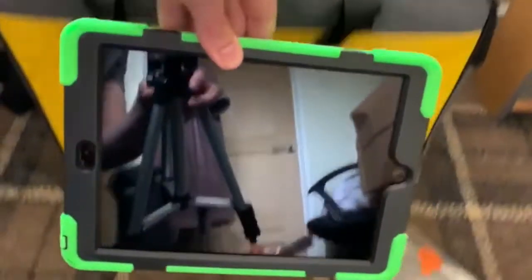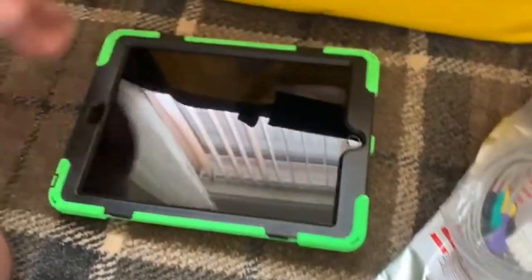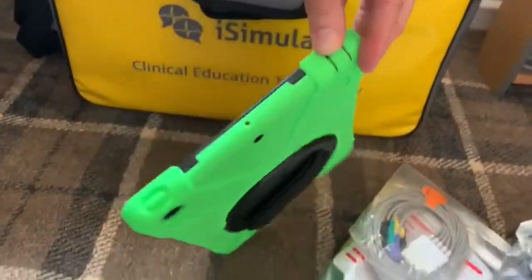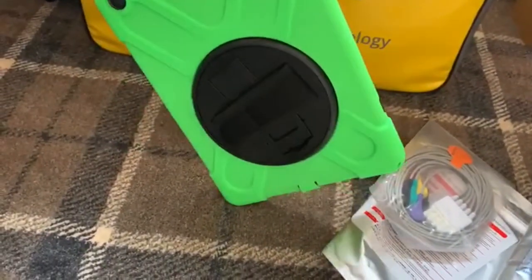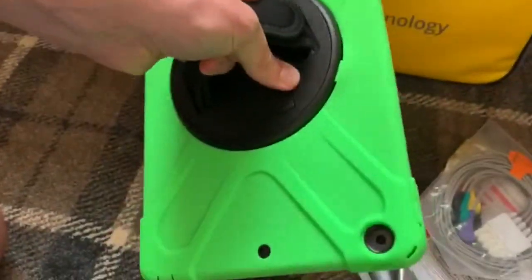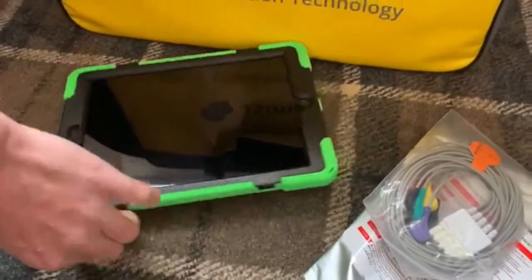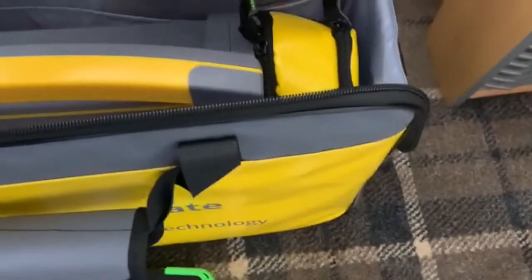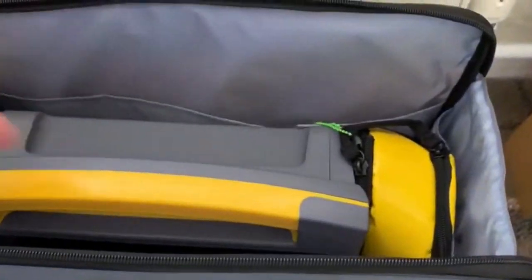We have one iPad 10.2, which comes with the clamp on the back. It's a bit robust. Bright green — matches the green tag. There's another pocket but nothing in that. And then finally, the tag.